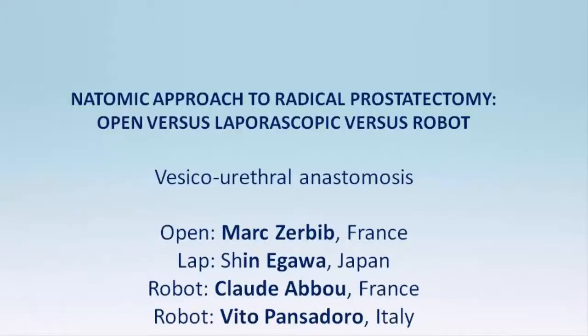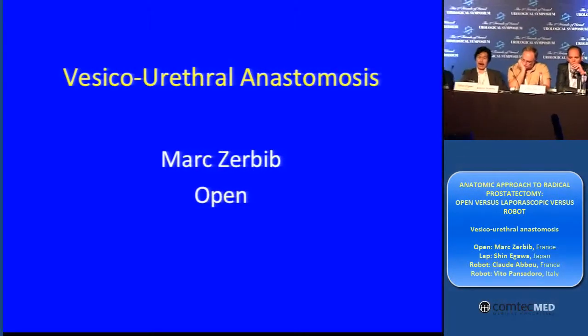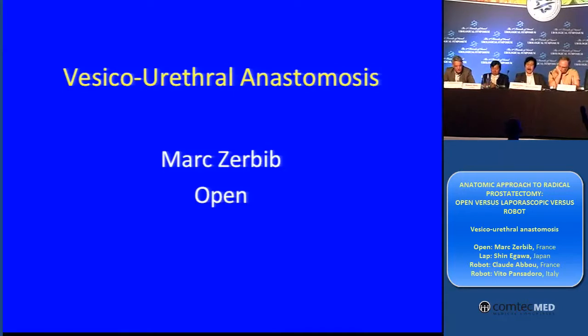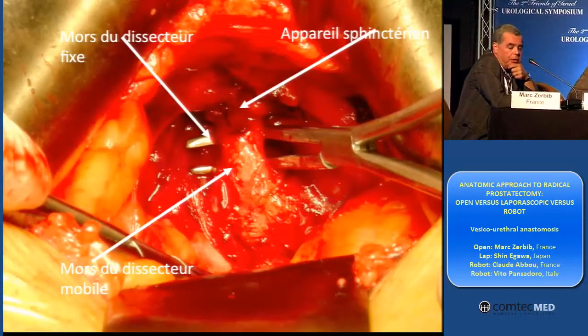Let's move on to the vesico-urethral anastomosis. This is our fourth part of the procedure. I repeat that I am going by a retrograde way after the Santorini ligature.